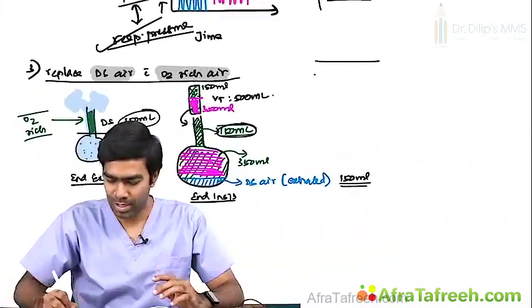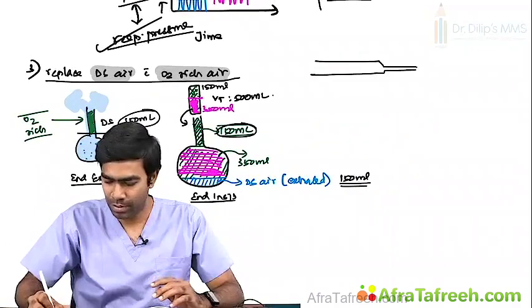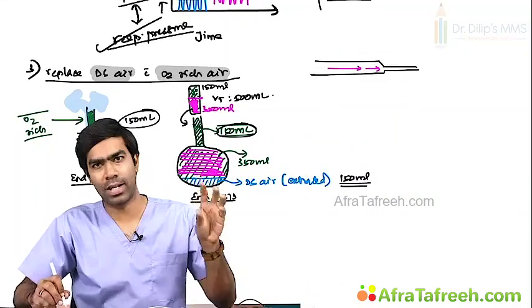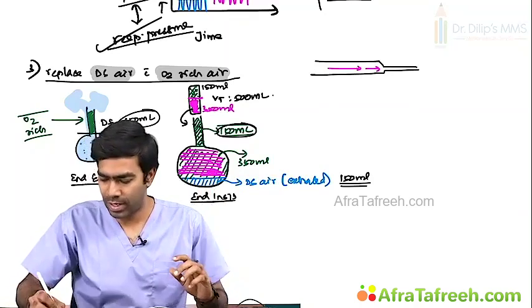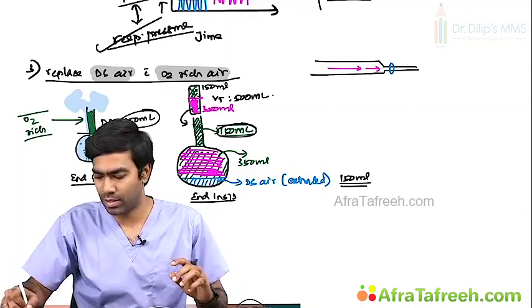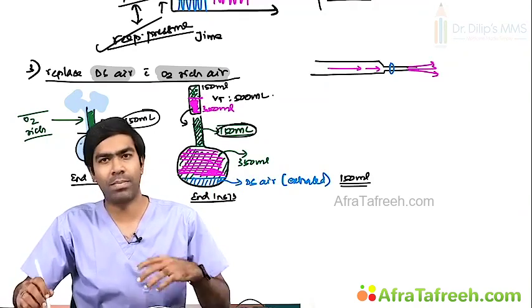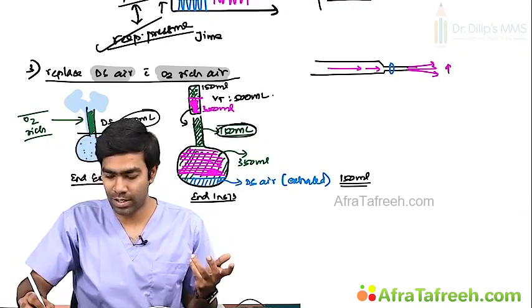So because it generates such high flows, this cannula that is placed here generates high velocities of oxygen, because the cannula size is very small. You know, there will be something called a Bernoulli effect. That also you have to know. Whenever a fluid column or a gas column is moving on, when it enters a constricted segment, its velocity will increase multifold. But remember, the pressure will drop, but the velocity will increase.